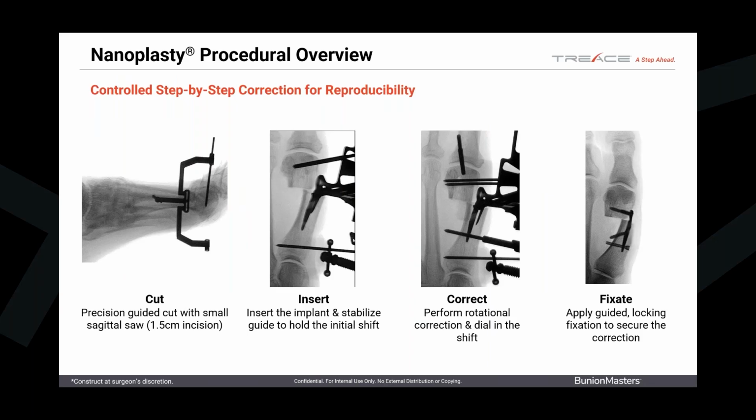Now this osteotomy should be a little bit more proximal than you think it should be to allow the plate to tuck behind the medial eminence. We don't want this to give a metallic bunion distally. We want to hide it. Now, 99 times out of 100, you will not need to resect the medial eminence. You're going to get 100% shift with this osteotomy, or pretty much 90% shift. And therefore, you will create a rectus ray and the prominence won't be an issue. There is a small percentage where you may have to shave it down on a very large head, but it's very rare. So just plan to tuck this jig proximal to the medial eminence so you can hide it.